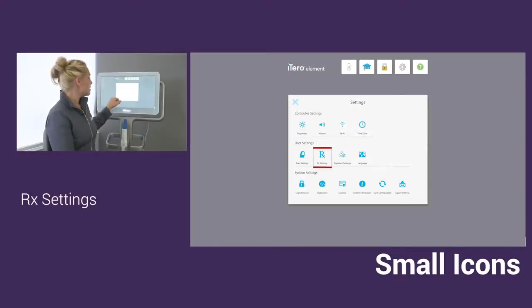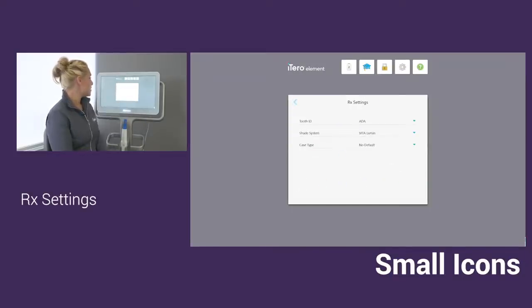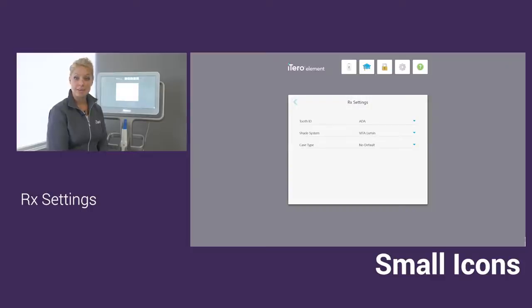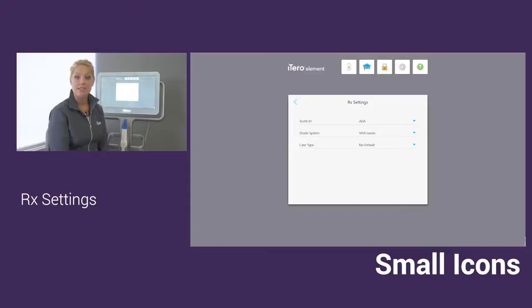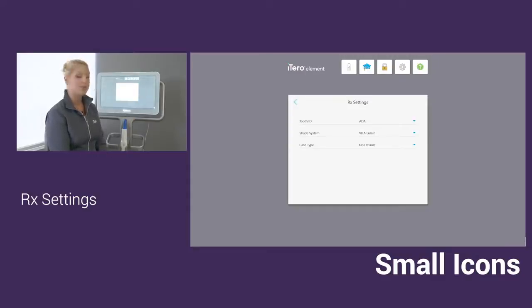In the RX settings, you can set your tooth ID number in here along with the shade system. We do have the Vita Lumen as the default, but you can drop down and switch to the 3D Master or other.